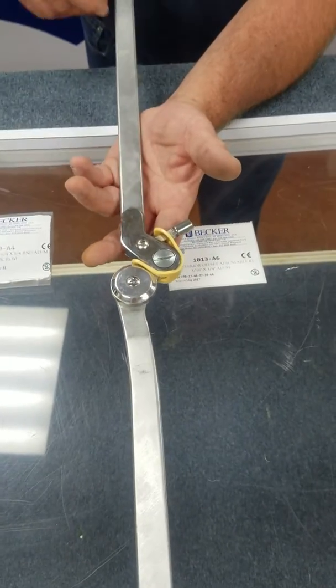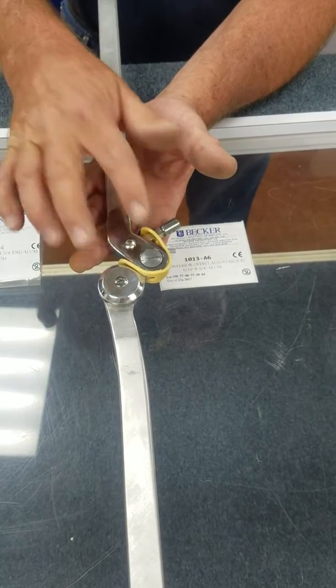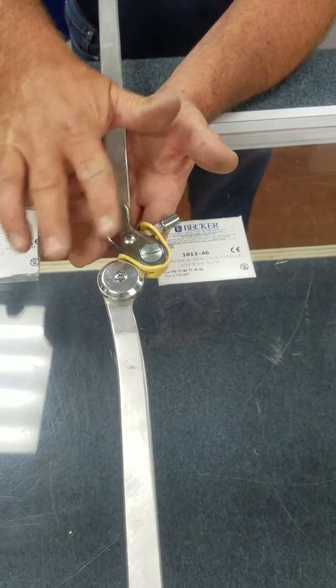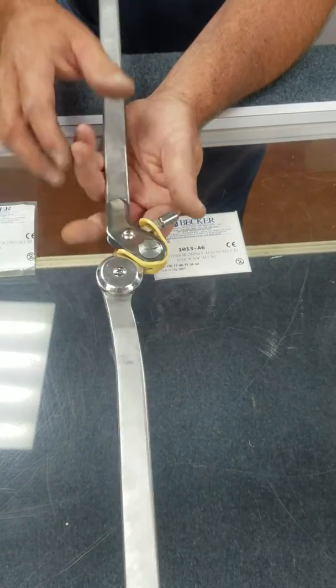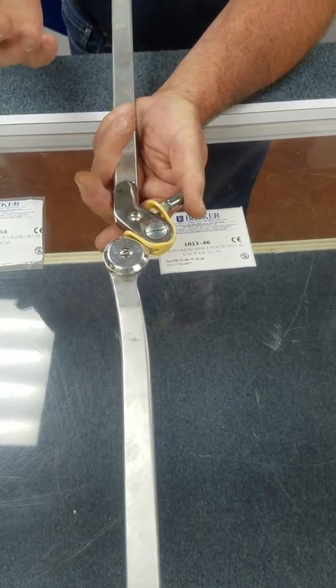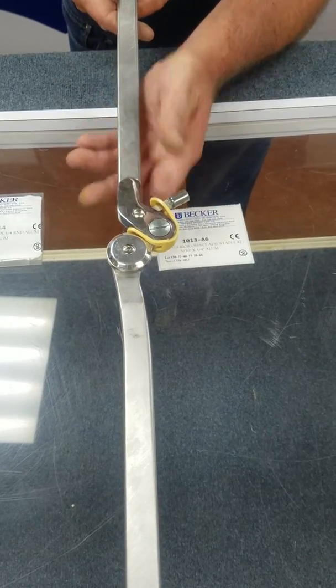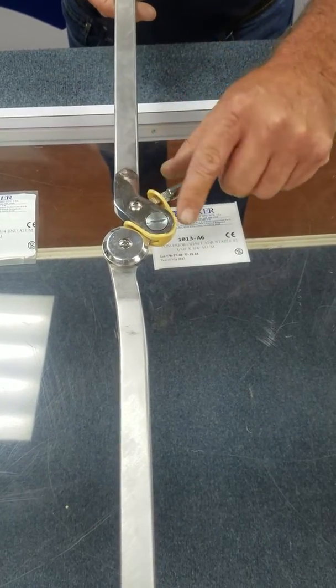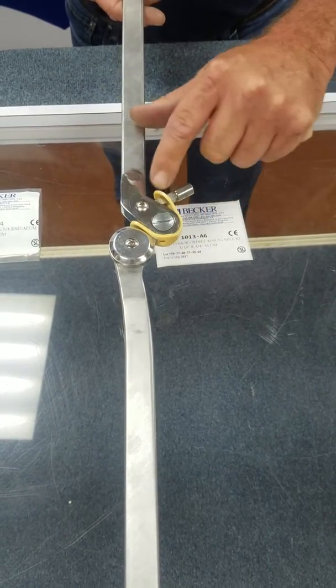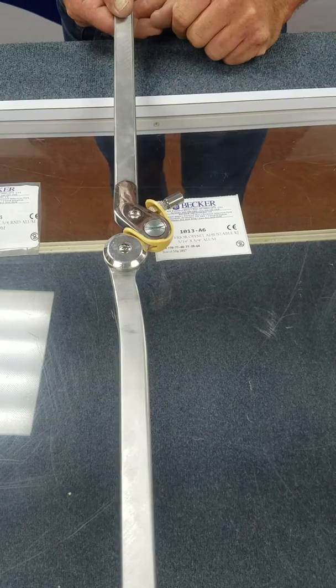The model 1013 is a posterior offset adjustable flexion knee joint with a bail that can be removed if necessary. It also has an automatic locking band.